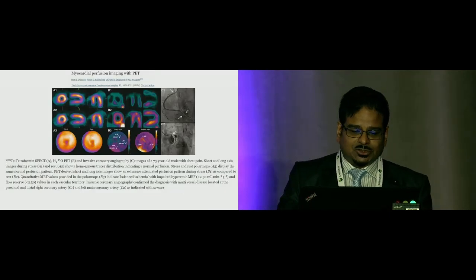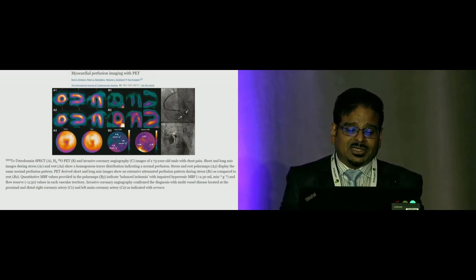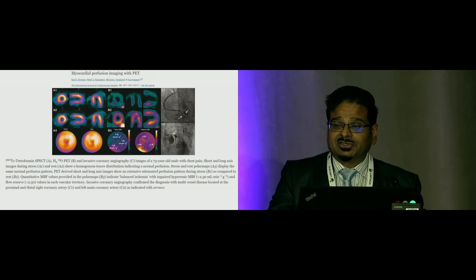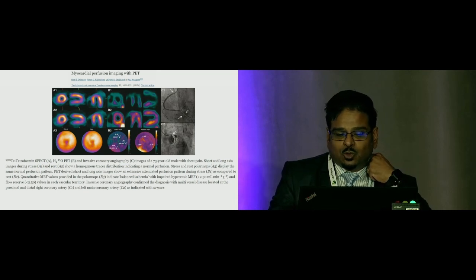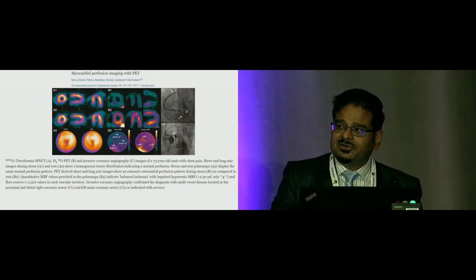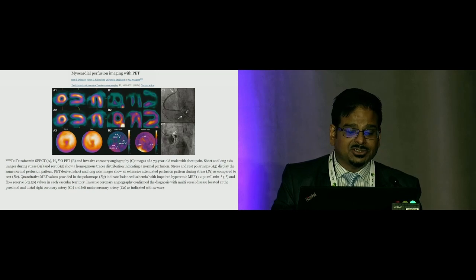Another interesting application that was also mentioned over here is myocardial perfusion. And the reason I'm mentioning it, on the left side, you can see with the conventional SPECT CT, there is a global ischemia. So when you have 3-vessel disease or triple vessel disease, you do not see a significant difference on the technetium sestamibi scans or tetrofosmin scans. But on the right side is a PET using O15 water, in which, because of the blood flow images, you are able to pick that up. What is also very interesting is with the oxygen 15 water, you can do the scanning of the entire body, and so you can pick up, as was already mentioned, cerebrovascular diseases and peripheral vascular diseases, amongst many others.